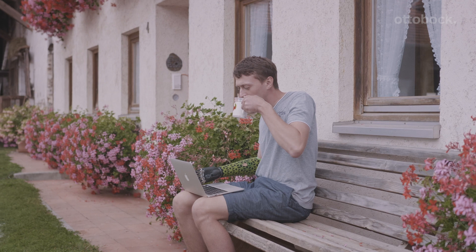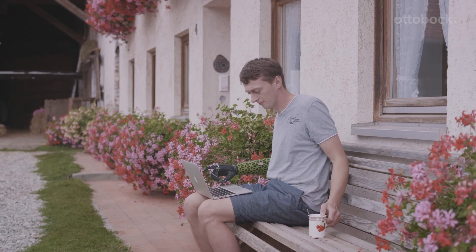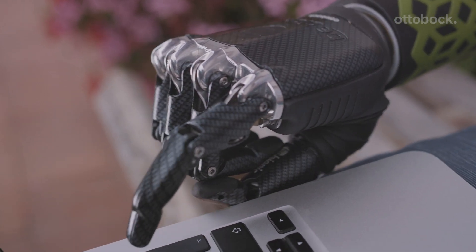The biggest difference is that you don't have to relearn everything. Now I just do open hand with the phantom hand and the hand opens, and when I do close hand it closes. The hand actually feels the same as the sound hand in your mind.